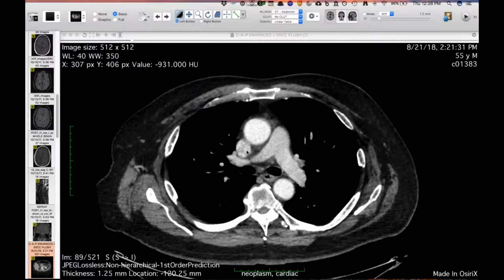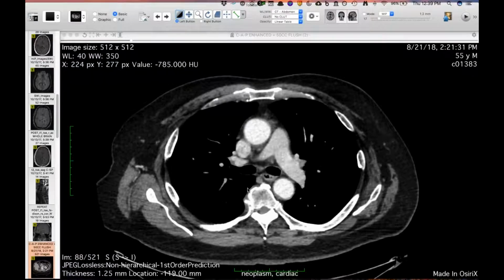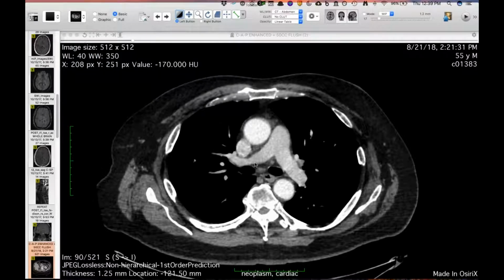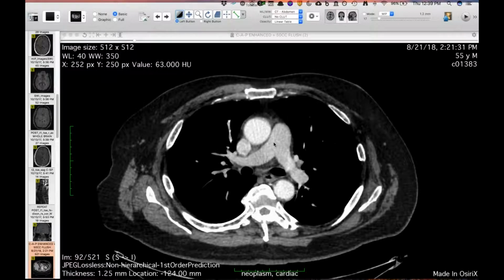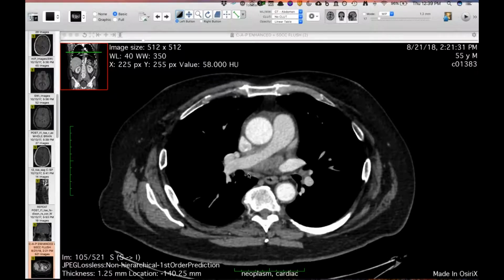Okay, do you guys see a CT? Mm-hmm. All right, well, this is Howard and David. This is for both of you. This came in on Tuesday, and I think I've got all of the information except path confirmation, but I know what the first question is going to be, and I think I have an answer for it when we get to it. So my first-year resident picked up this case, and as we were reading it out, he said the history is splenomegaly, evaluate for lymphoma. Patient had some constitutional symptoms and apparently splenomegaly.